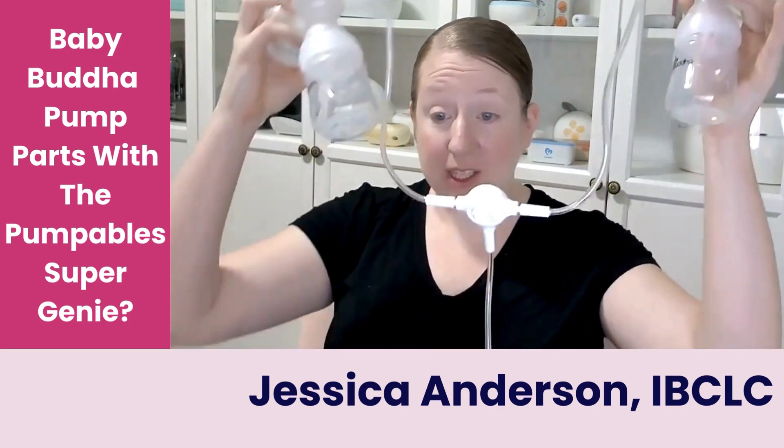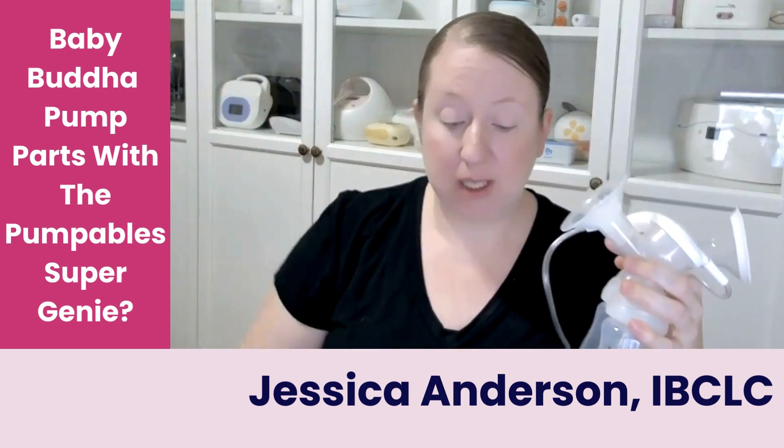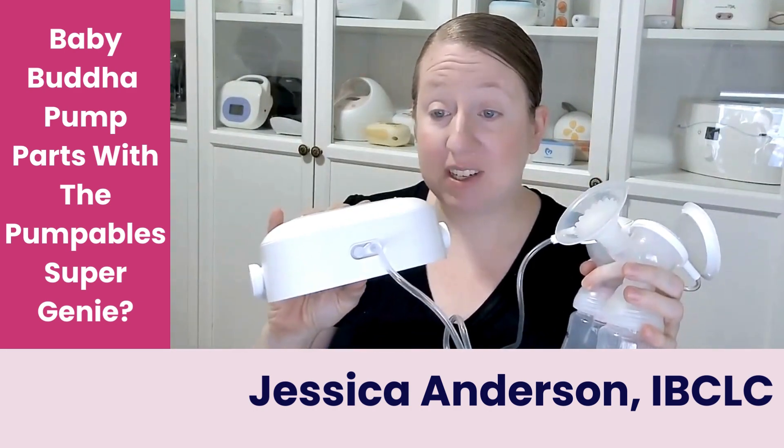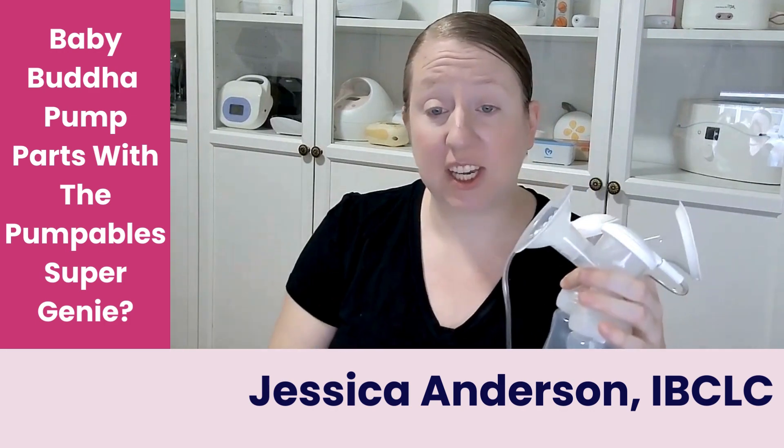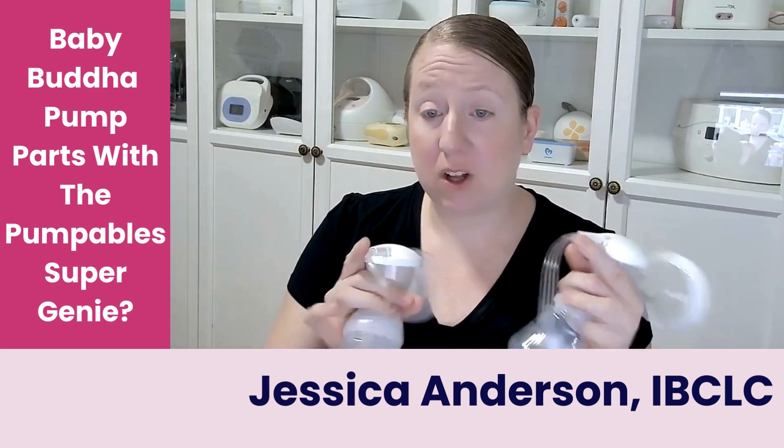So this is just a case of — yes, technically we can hook it up. She did ask how we hooked it up. I literally just took the Baby Buddha tubing, pulled the white adapter off the end, and hooked it onto here. Alternatively, you could just run two tubes to the Super Genie and put the bare tubing on the back of the Baby Buddha backflow protectors.